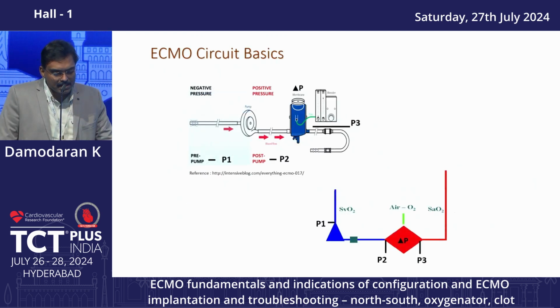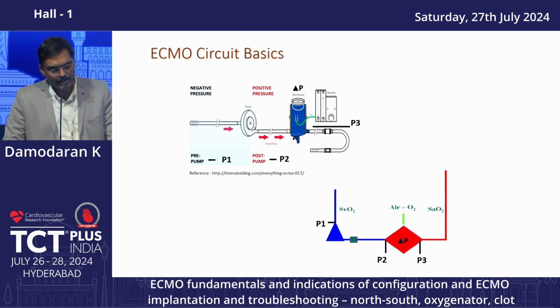You should know some mechanics of this ECMO. When there is a centrifugal pump, obviously there is a negative pressure just before the pump, that is, from the vein to the pump. This pressure should be maintained somewhere around -40. If it is too negative, obviously there is no volume, there is no preload.